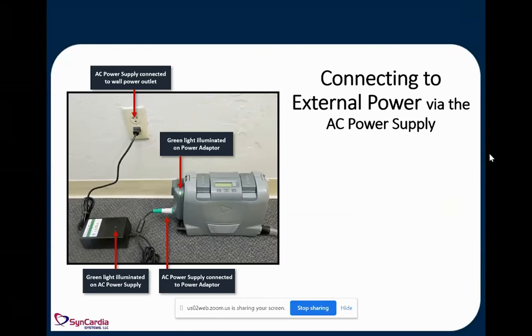So the Freedom Driver kind of acts like a car battery, where if it's plugged in, it is charging the batteries in the driver, if that makes sense. However, if they're too low and they're alarming and you plug it in, the alarm won't stop until they've gone above their threshold. So we might just advise you to change them out one at a time slowly anyways, because it's real loud and annoying.